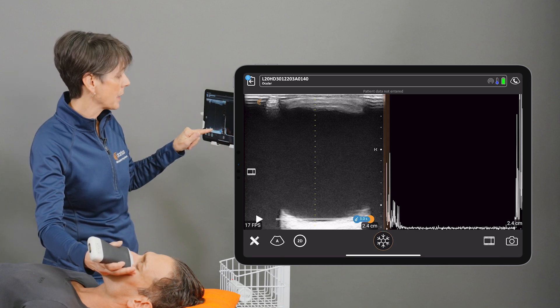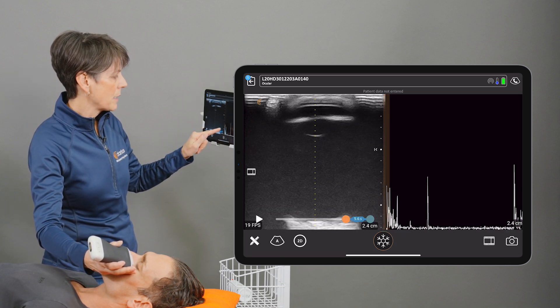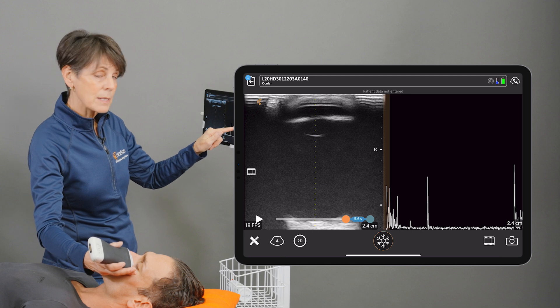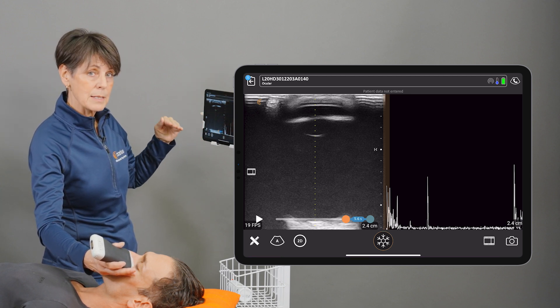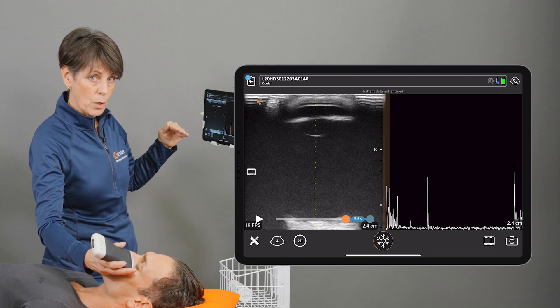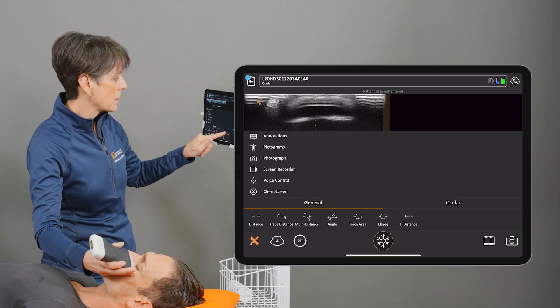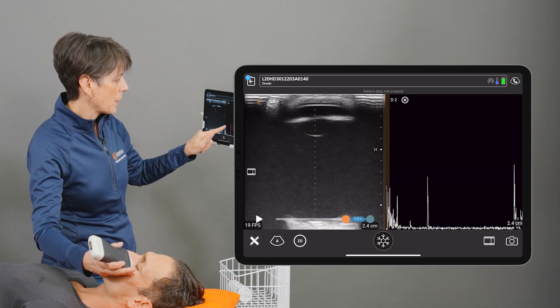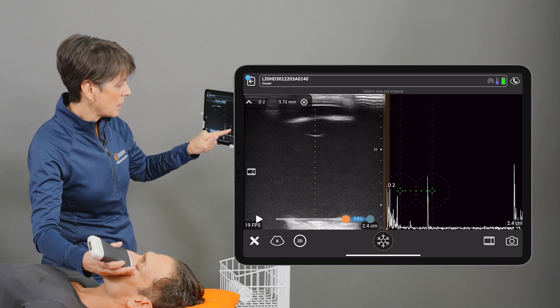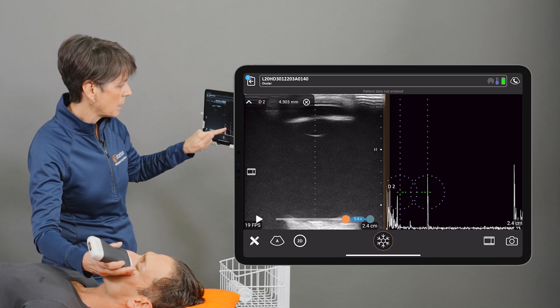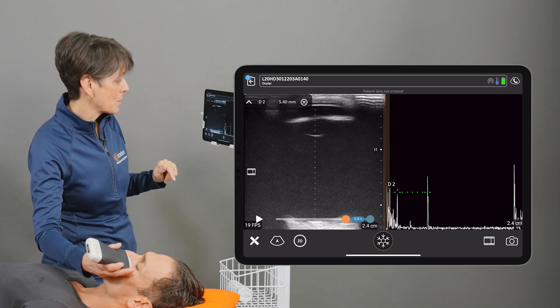Now if there's something that I missed, I can cine back. Right here are the different spikes that represent all of the structures that the sound is encountering on the way through the eye. I can now go in and measure distance — say, from the anterior to the posterior lens — and we get a nice, accurate measurement.